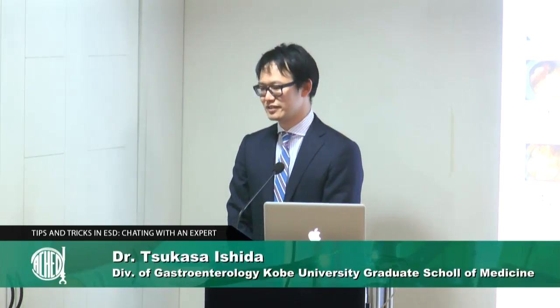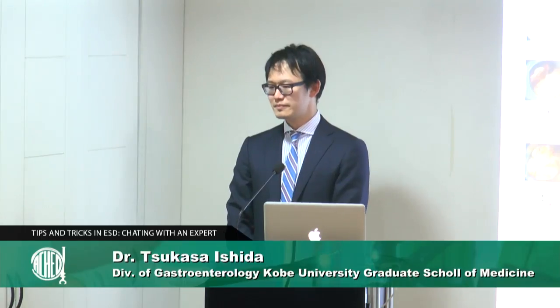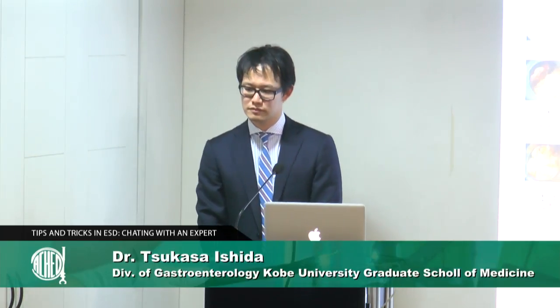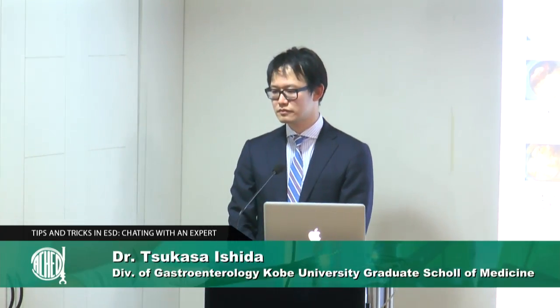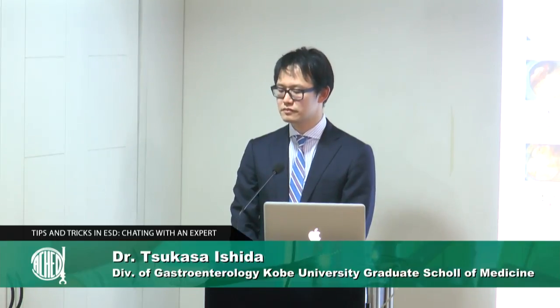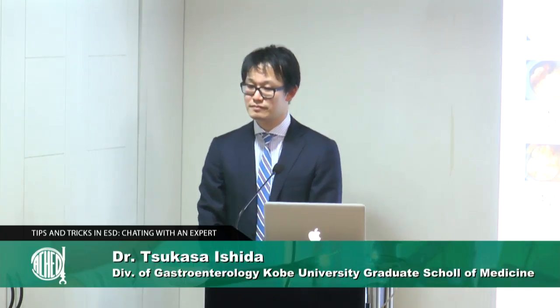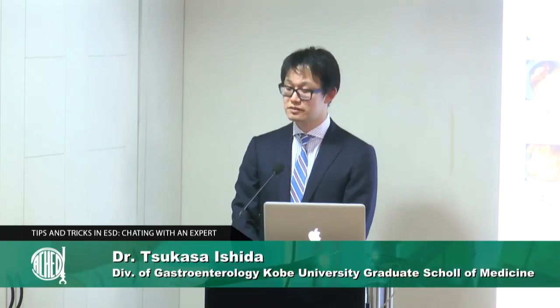Zion Medicals. But I think it should be very interesting for Adolfo because, as far as I know, he described it. I don't remember. Adolfo, si estás ahí, por favor, dinos dónde publicaste tu método por el WhatsApp. Because Dr. Parra published this method with a clip, but with a rubber band, like for a dentist, and use the same. Then a second clip catches the rubber and goes to the healthy mucosa. But he used it mainly in the stomach. I think maybe he has never used it in the colon, maybe in the rectum, but not in the colon.